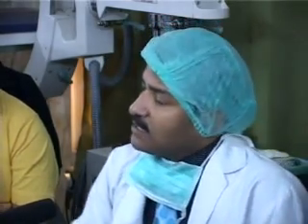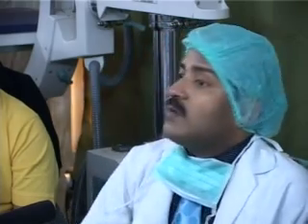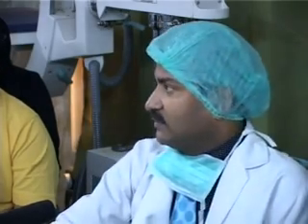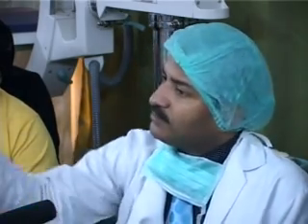This was just to achieve your pneumoperitoneum before putting the trocar. Now how much gas is used after introduction of the trocar? Suppose your surgery continues for 1 hour, then no matter how good you are, how good your instruments are, an average of 18 liters of the gas will be used. 18 liters of gas will be lost.